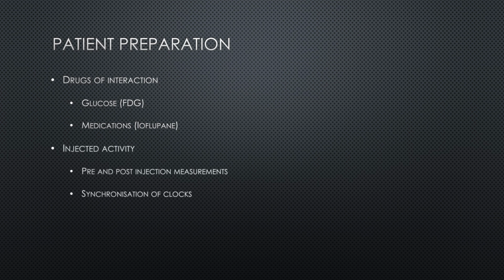Another thing that we have to do when we're doing this quantitative imaging, which is more of a burden, I think, in SPECT imaging where it's not routine compared to PET imaging where it is, is that we need to measure our syringe of radiopharmaceutical before and after injection to understand exactly how much we've administered to the patient.